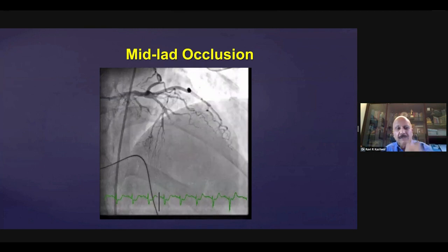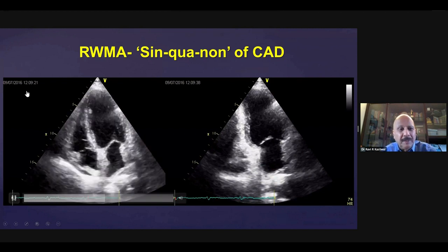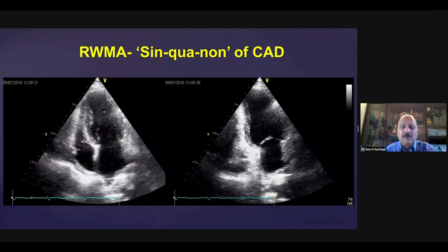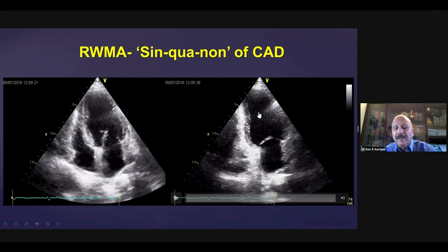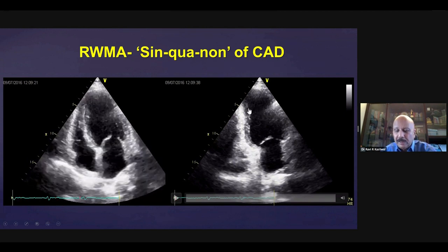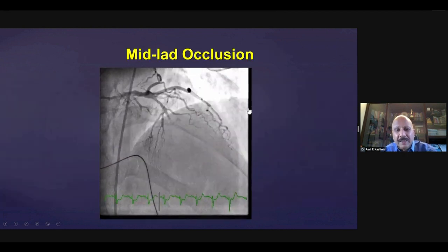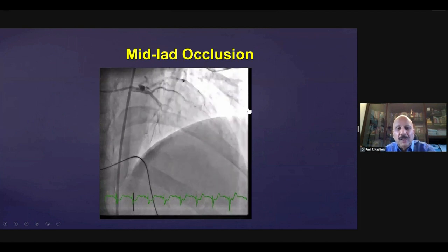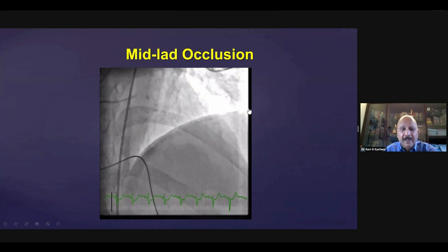So this was the patient, and you can see the wall motions very clearly here. In the mid-distal, in the distal septum, apex, and mid-lateral wall. Similarly, in the second view, you can see very clearly the apical wall and the distal septum. And this is what we found on an angiography: the D1, D2 had taken off, and the LAD shows a 90% occlusion in the mid-LAD. The wall motion abnormalities were already there.